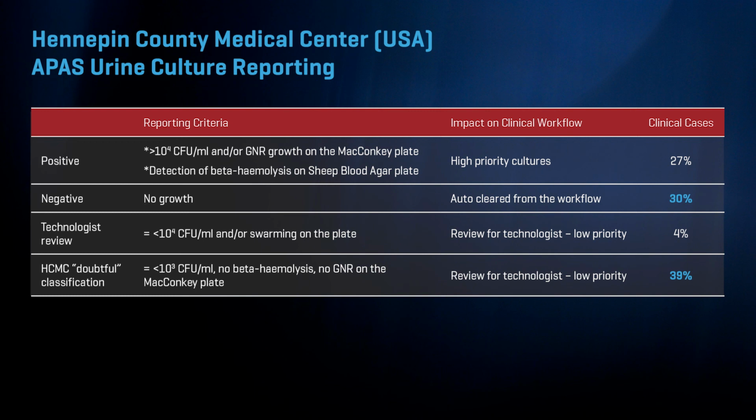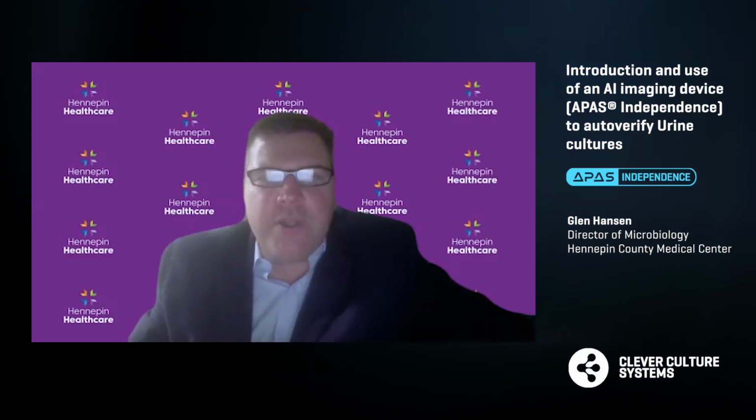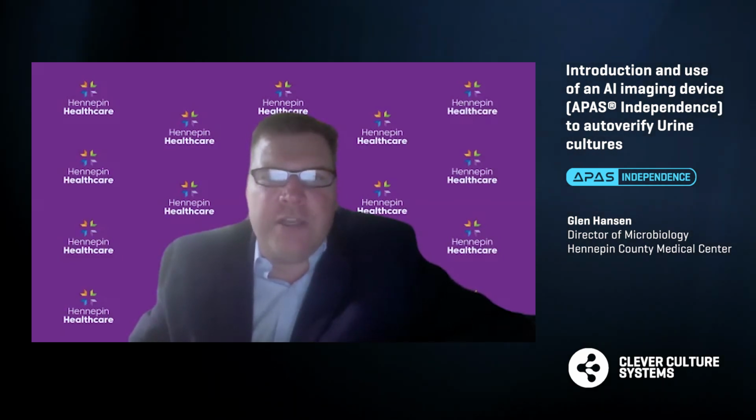After almost 3 years of working with the APAS system, we have enough internal data to suggest that these cases are rarely clinically significant. And we've asked the system to potentially auto-clear both our negative and this doubtful category. This allows us to remove almost 70% of the workflow that is auto-cleared by the APAS in the clinical workflow spectrum, while focusing the techs on the cases that we know are truly informative and truly clinically significant.